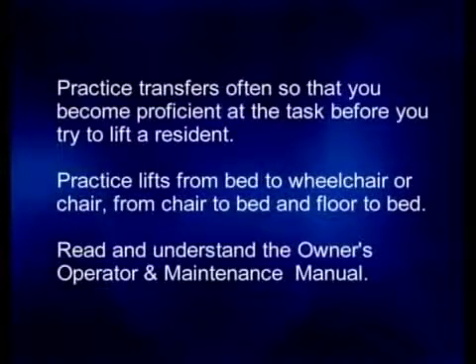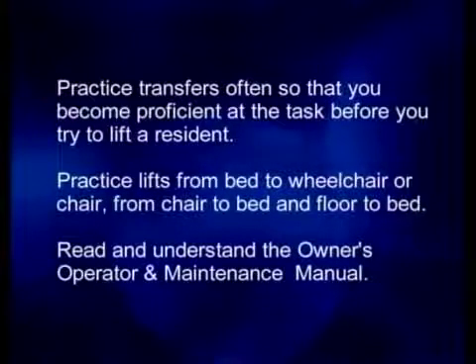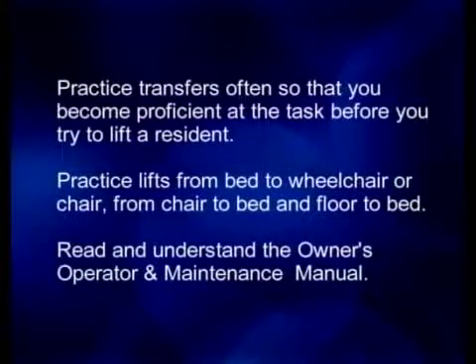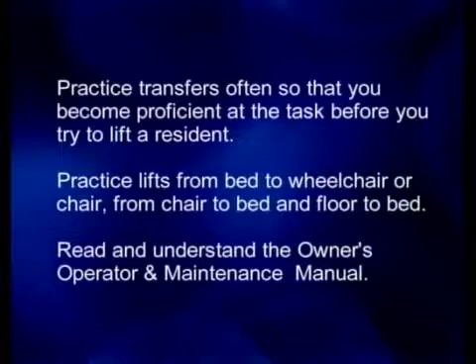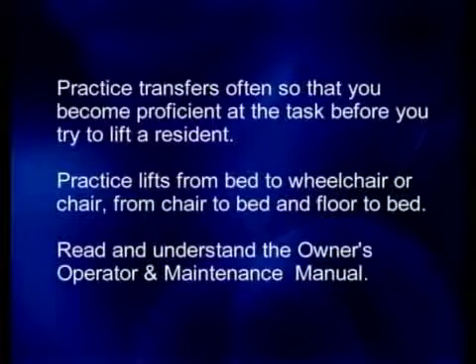Practice transfers often so that you become proficient at the task before you try to lift a resident. Practice lifts from bed to wheelchair or chair, from chair to bed, and floor to bed. Read and understand the owner-operator's manual.